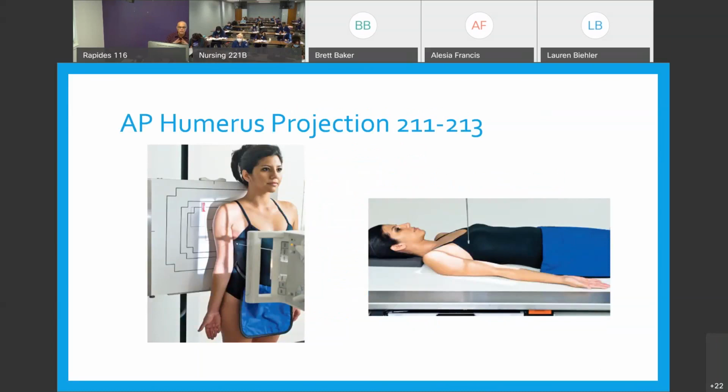Here's the patient being done. You can do it standing, which we said was the easiest for us to position and less discomfort for the patient. Think about it. You've got a crushed arm, you've got to crush something in your extremity-wise. Standing up, protecting that arm is easier and makes me feel more secure than laying on a table and having the weight of your body pull that arm. But it can be done whether it's done erect or supine, recumbent. All right?